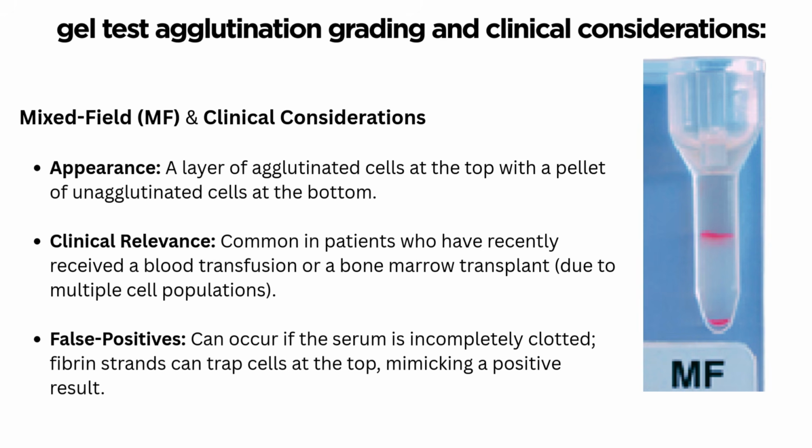Another essential point to consider here is the possibility of false positives. These can happen if the serum isn't completely clotted, leading to fibrin strands that trap the cells at the top of the gel column, which mimics a positive reaction. This could be misleading and must be carefully managed to ensure accurate diagnosis.